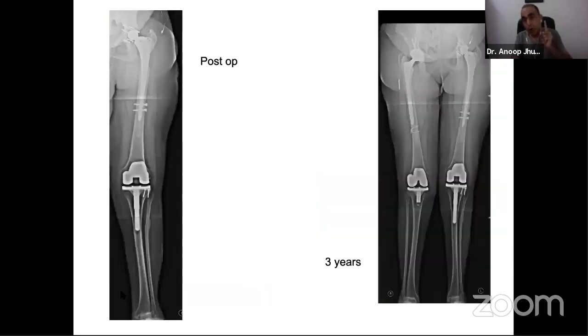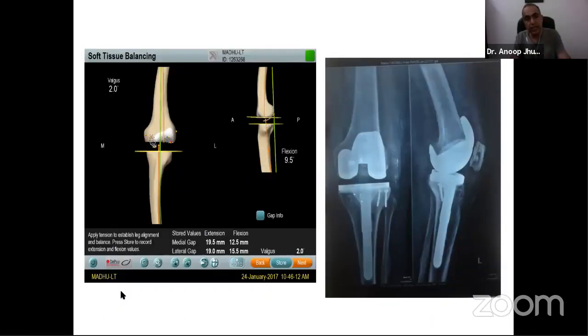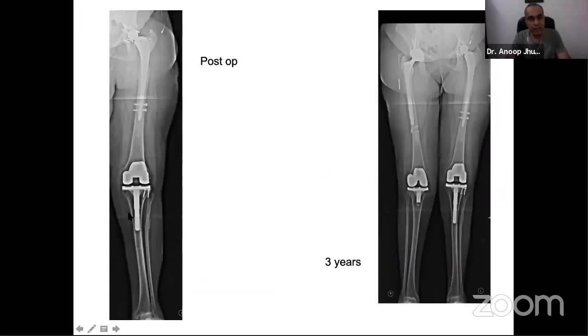It looks like, because the tibia is in valgus, and you can see here that the tibia has a valgoid bowing. This is the immediate post-op X-ray, and it's interesting to observe that after 3 years, this extra valgoid bowing, which was due to lateral compartment loading, corrects itself when we remove the degenerative process. And you can see we are following these patients for a long time and observing what happens to the valgoid bowing of the tibia, and that tends to decrease once the load-bearing axis comes to near neutral. 1 or 2 degree valgus is also an advantage to the hindfoot valgus that the patient has. And once the valgoid bowing corrects over years, the knee becomes nice and neutral.